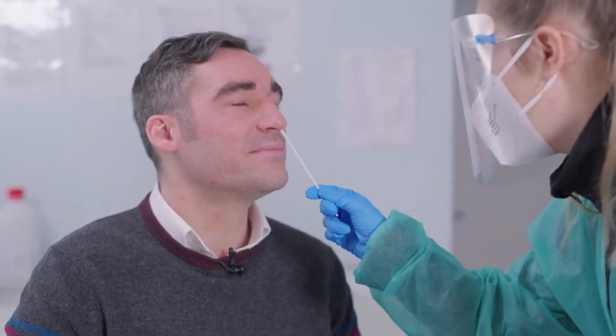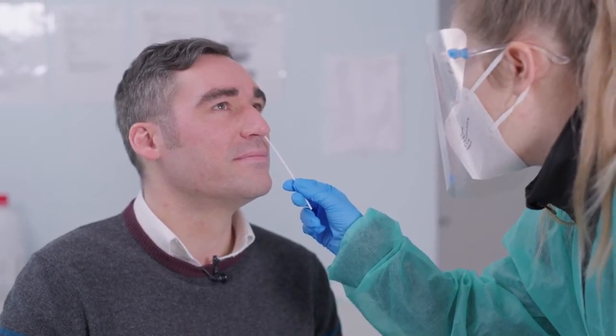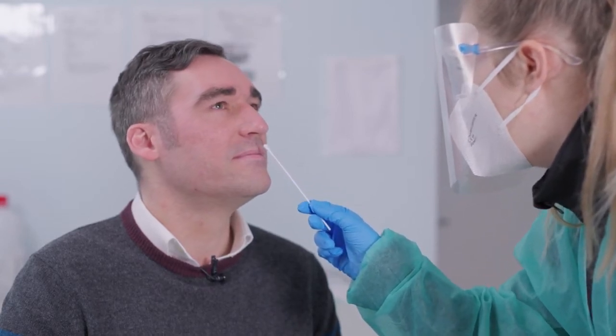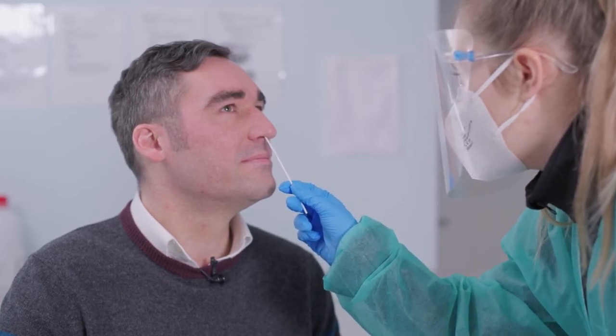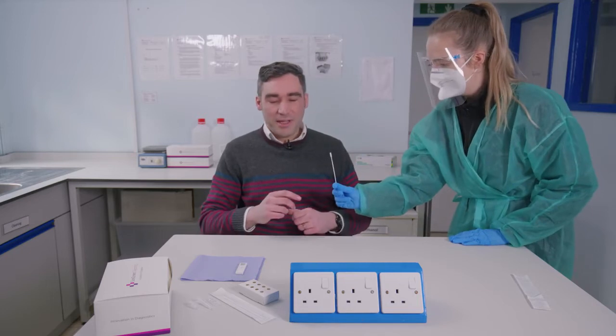Put your head back to slide. And now we're going to do the second nostril. So if you just hang on to that for a moment.